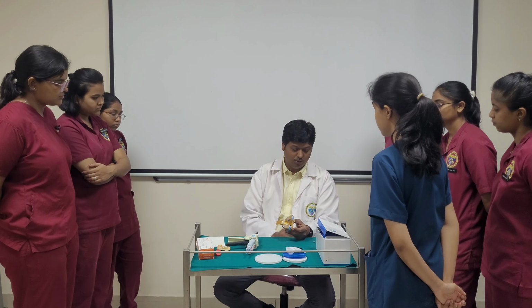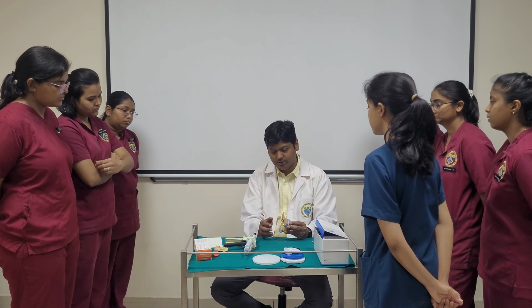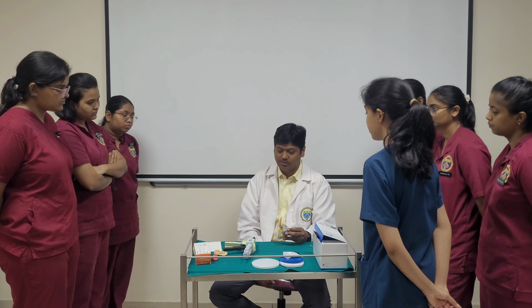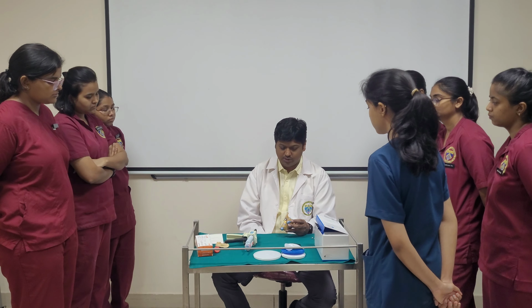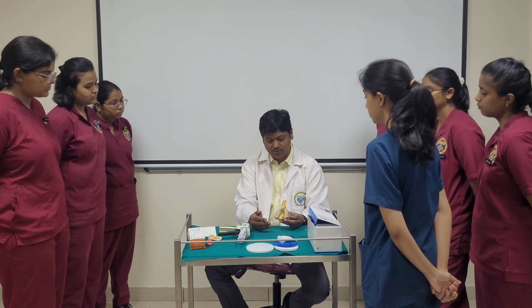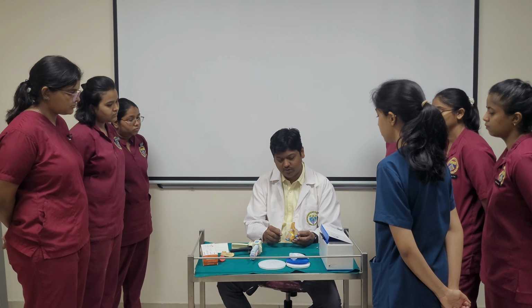But in your open tray, it would be more precise. Why? Because you will be unscrewing it inside the patient's mouth only. When you take it out, it will come out with the impression. So the chances of micro movement are less in case of open tray. That is the advantage. Whenever we are doing a single implant or single-unit implant crown, closed tray should be fine. Whenever we are doing multiple implants, more than 2 or 3 implants, it is always better to do it with the open tray, as the chances of error are less.